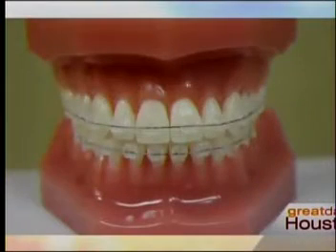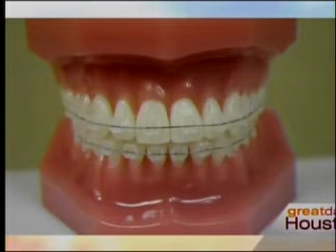So you have the traditional metal braces, and let's take a look at some before and after pictures of the difference that can be made with those kind of braces. We have those pictures up there. All right, those are coming, but while we're talking about that, there are also clear braces, which kind of look like the metal braces in terms of structure, but they're clear. Right, they're a little bit more cosmetic, so they're not as noticeable. Yeah, and then there's the so-called Invisalign, which I'm wearing right now. You had no idea I was straightening my teeth right now, right? Right, so there's the clear braces right there. And then the Invisalign, which is kind of the newest technology, I would imagine.